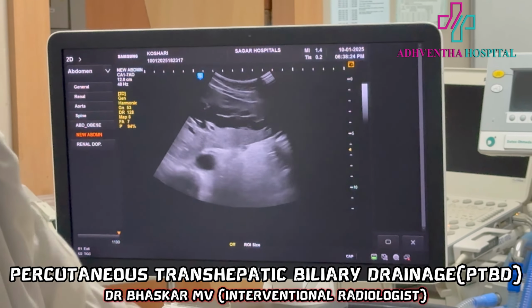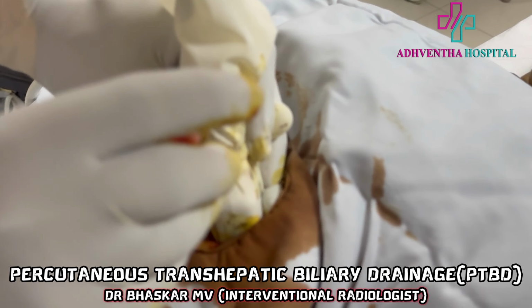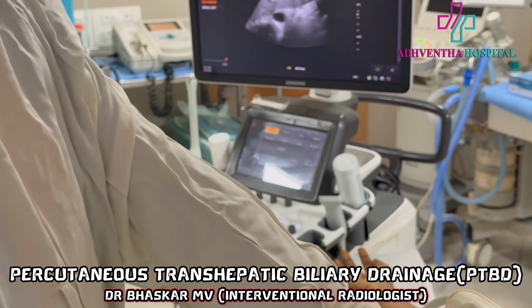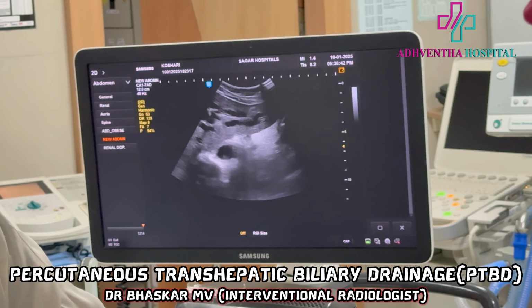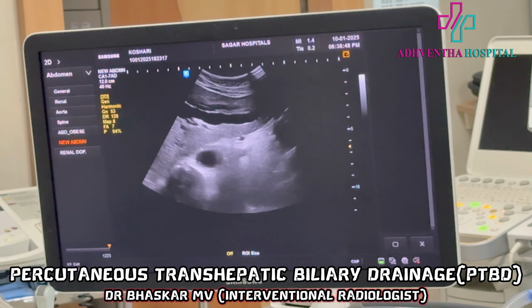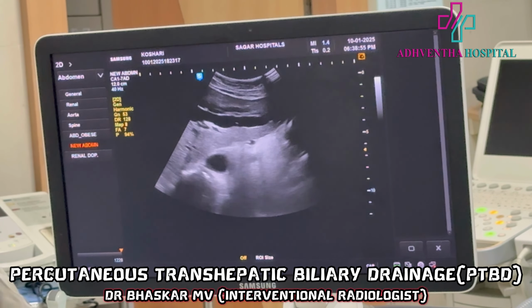This is a needle here. So we need a little cranial position. I can just turn, because this is a stiff needle. I can turn around whatever way I want. See, can you appreciate that? See here, I am wobbling the needle. So now I am puncturing this biliary radical.